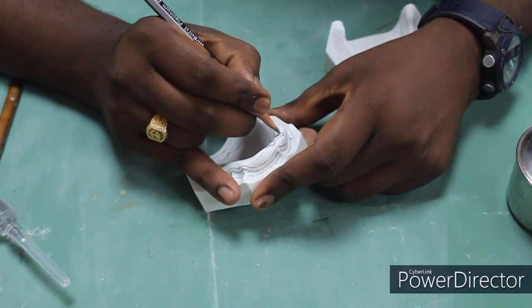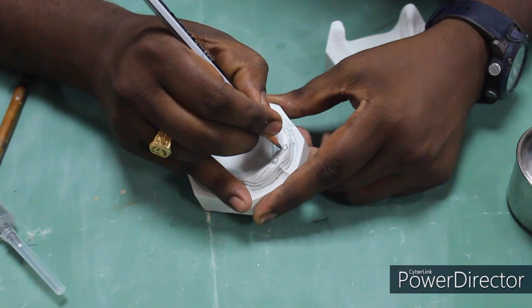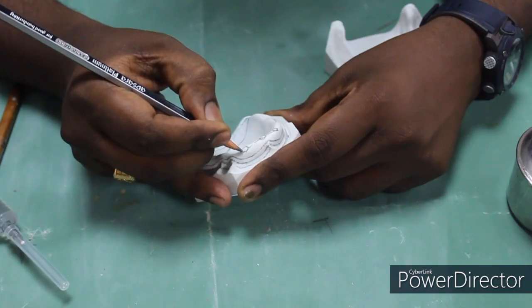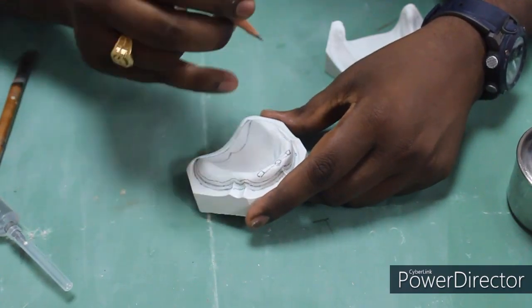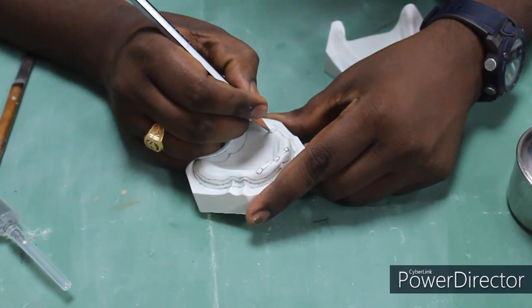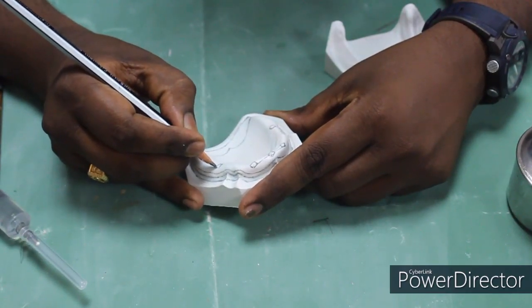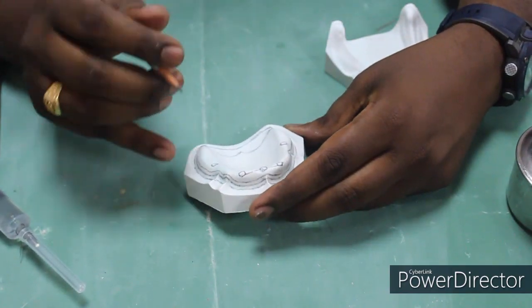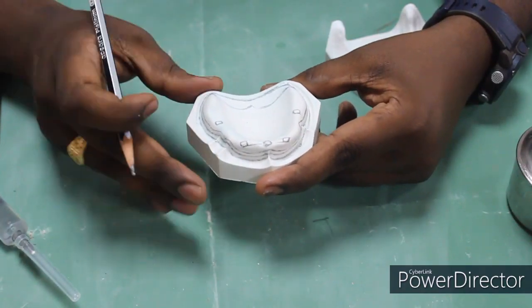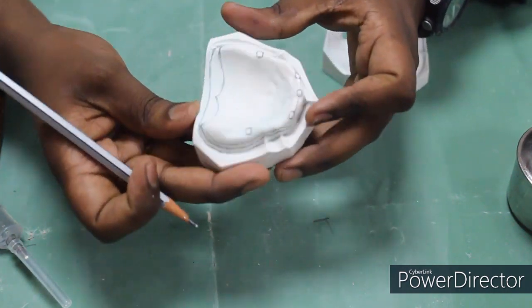Here you can draw the stopper of 2 mm by 2 mm dimension in the canine region, and 2 more stoppers in the first molar region. The functions of the stopper are that it prevents the vertical displacement of the tray, and it also provides uniform thickness for the impression material to flow during impression making.